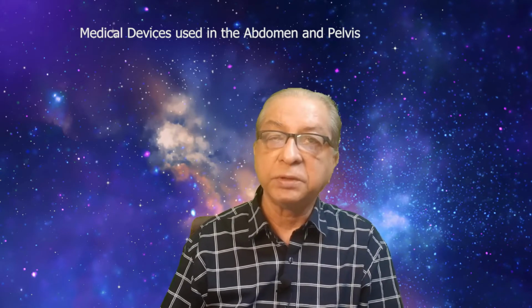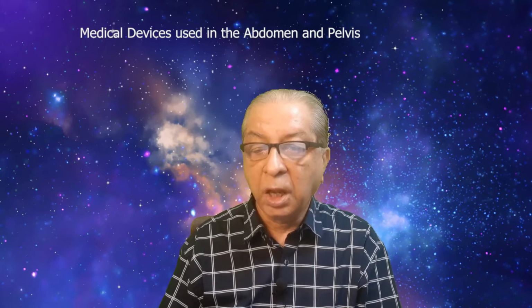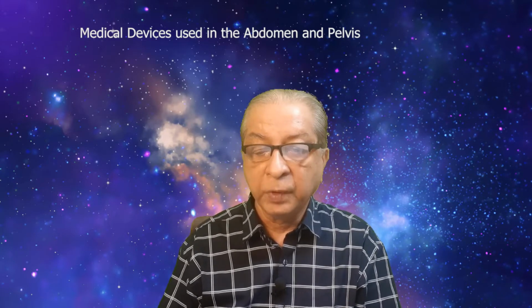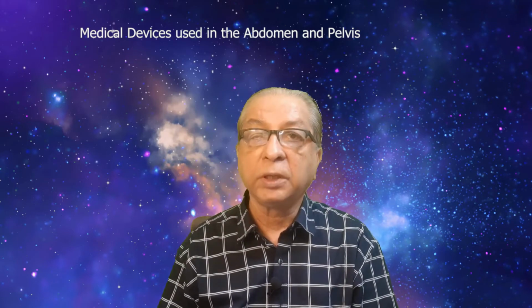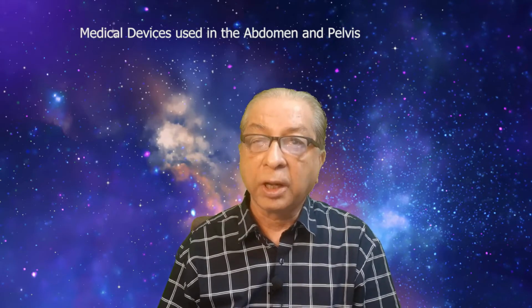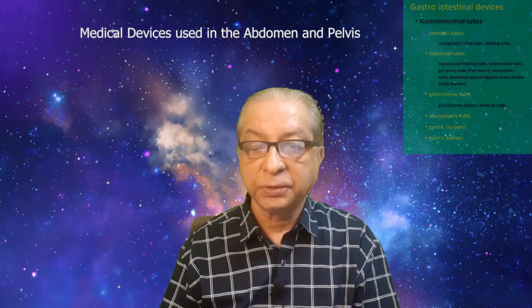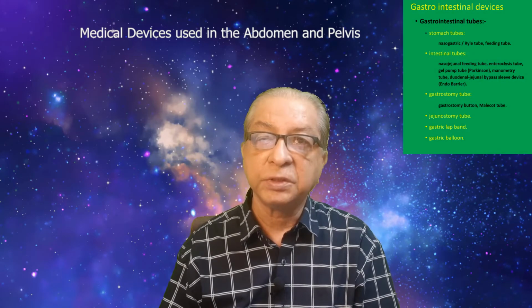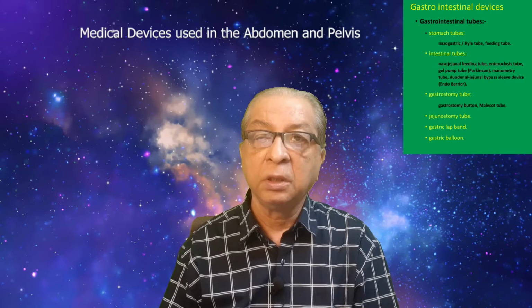and the devices may be very common for the thorax or chest and the abdomen, considered incidental and non-pathological. However, it is essential to be aware of the complications of the devices. In the thorax or the abdomen, the main devices will be tubes, because for various diseases, tubes are used to drain or provide medicine or support.